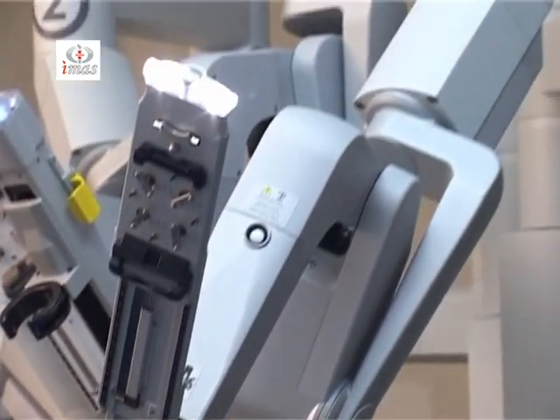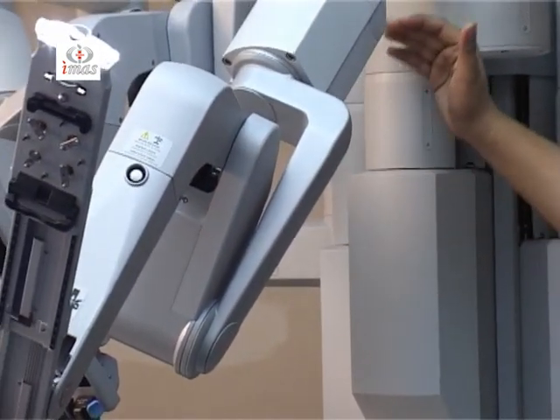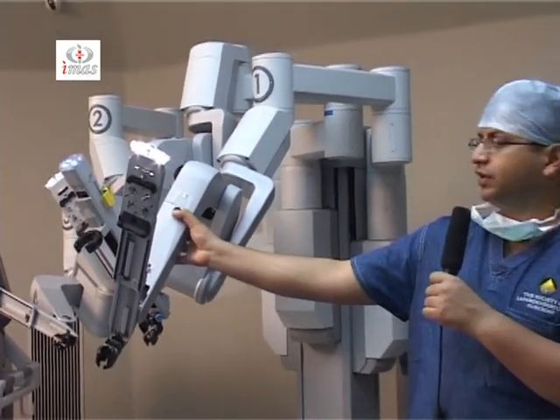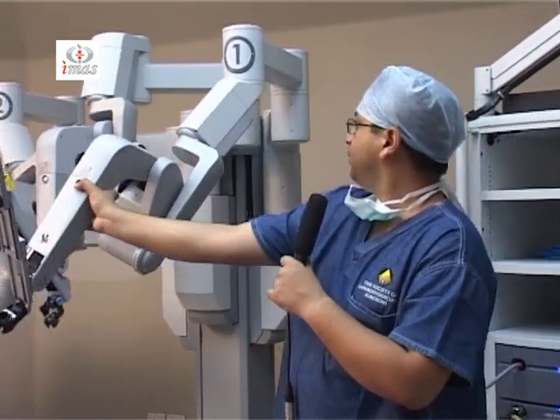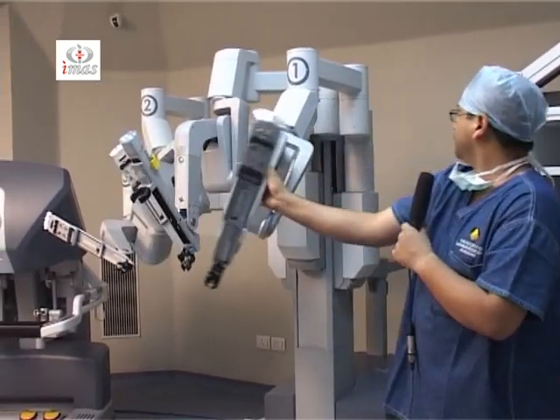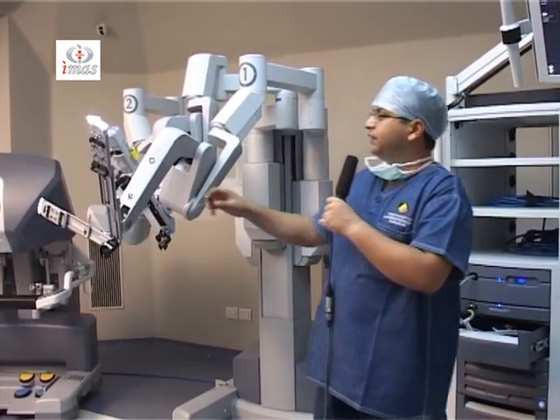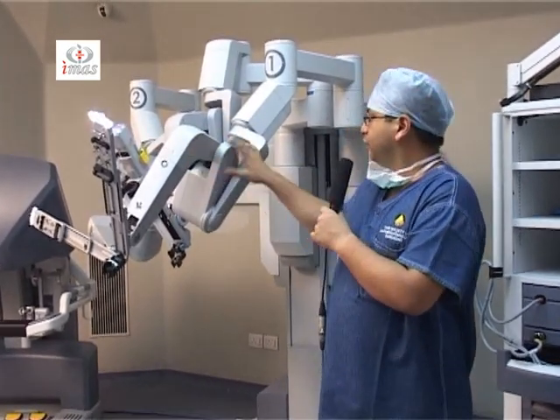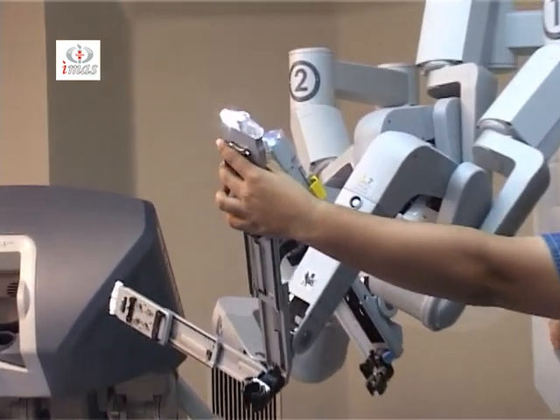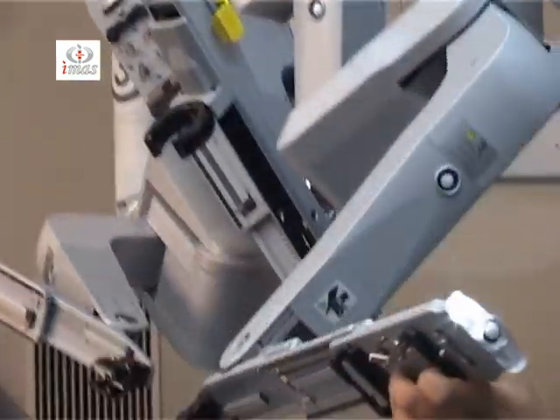This is the white portion of the arm, and this is the silver portion of the arm. The joints which are in the white portion of the arm move by pressing this port clutch button. As you can see, I am able to move the arm down and up and in various directions by pressing the port clutch button. And by pressing this clutch button, I can move the silver portion of the arm. If I press this, I have to release this rather than keep it pressed, and I can move the silver portion of the arm like this, in and out, rotate it.